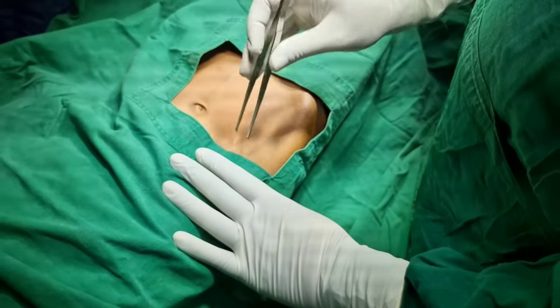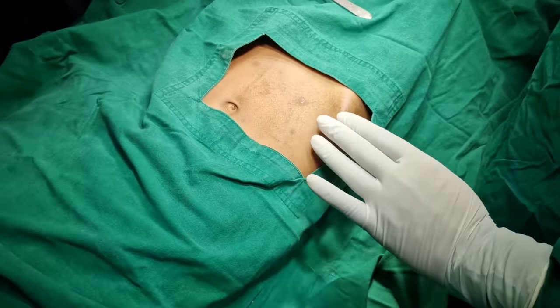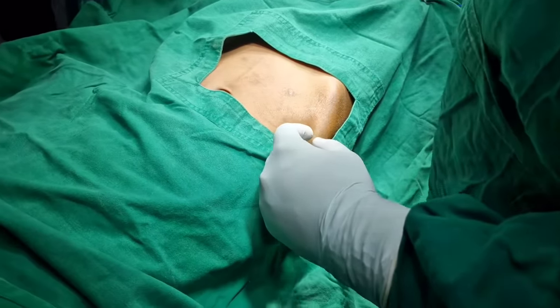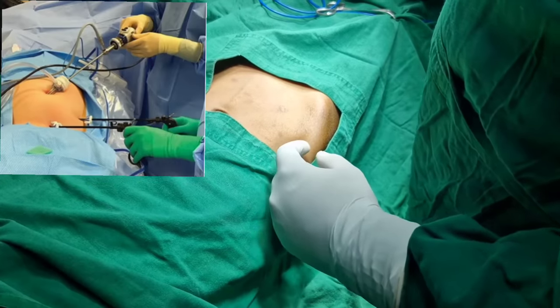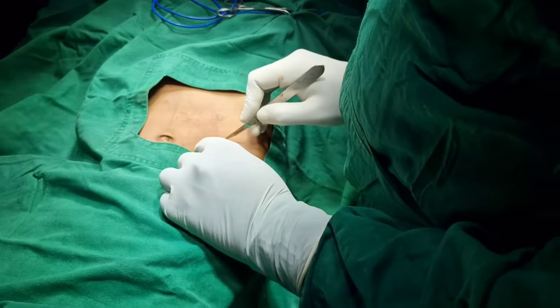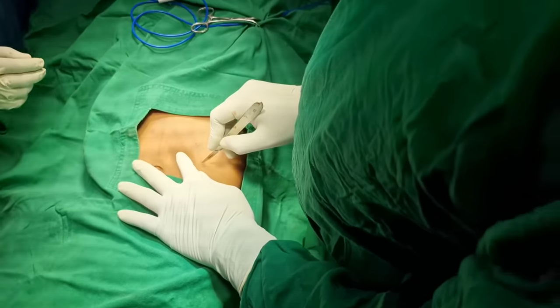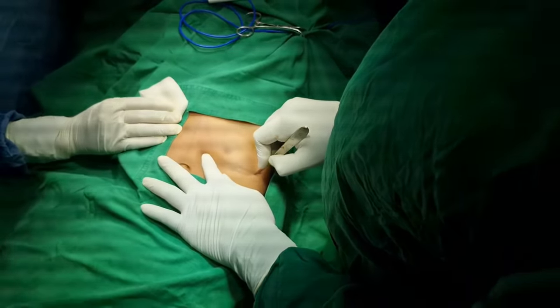Today, I am going to present a live surgical video of open appendectomy and techniques of doing it more precisely. Most of the time, it is done laparoscopically, but every surgeon must be well known for doing open appendectomy. This is the most common major surgery performed by trainee surgeons during surgical residency.